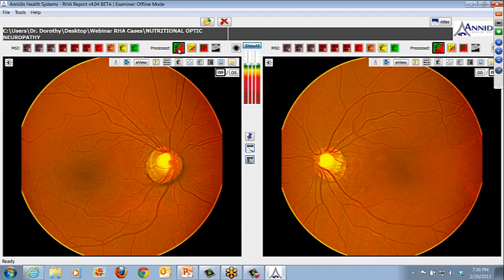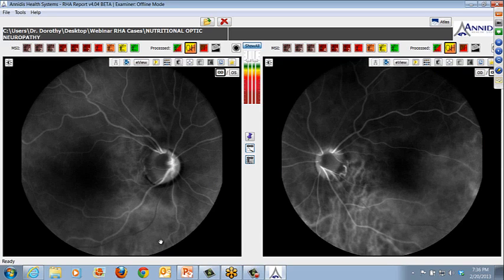But of most interest here, so you're thinking, okay, does this patient have glaucoma? She's young. She had no other secondary findings, normal IOP, certainly not a vasculopath, no family history. And after much discussion with her and her mother, she had severe and suffered for many, many years from anorexia nervosa. And I did a visual field, but this is what her nerves look like on the oxy-deoxy map.